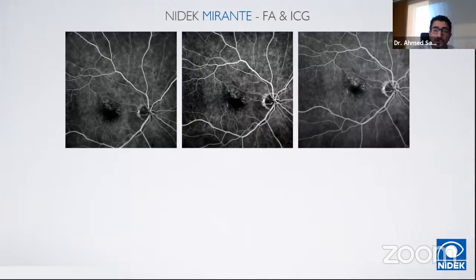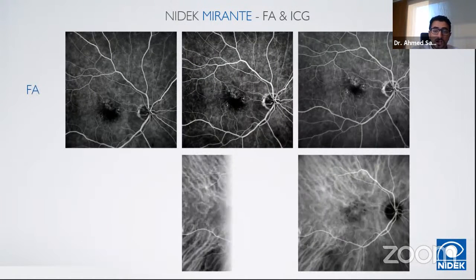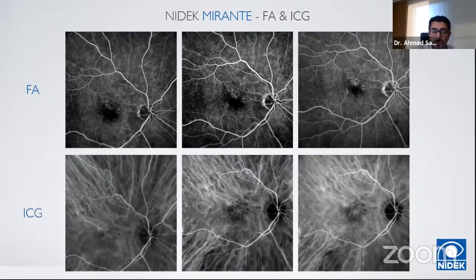These are examples of our FA images, and these are examples of our ICG images.